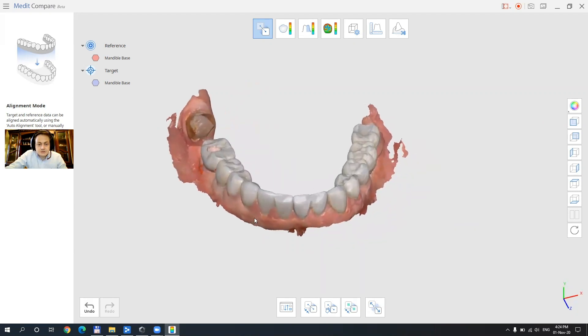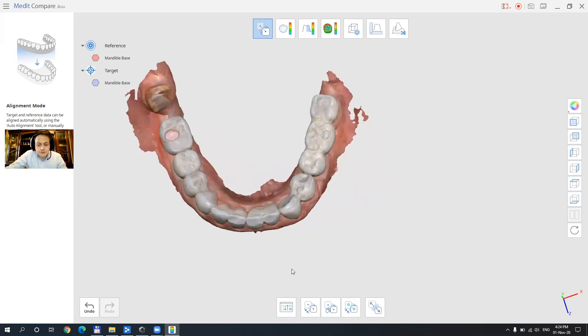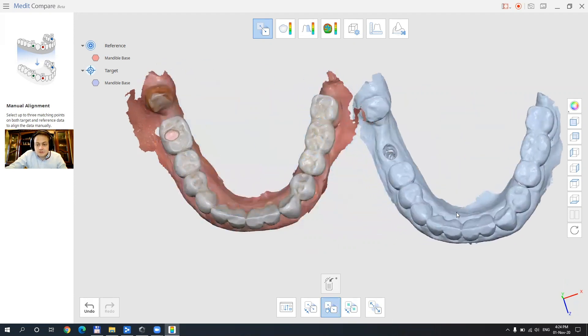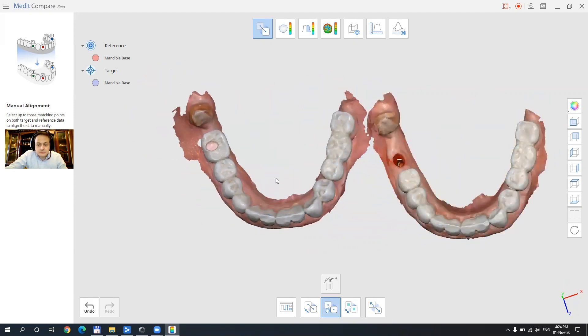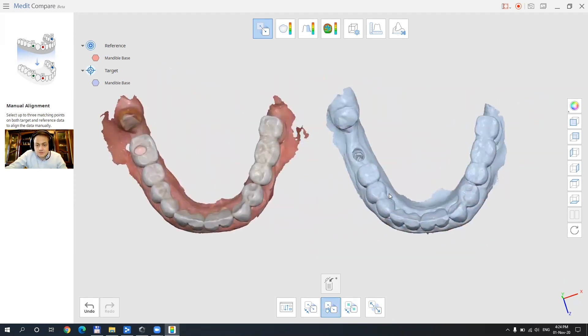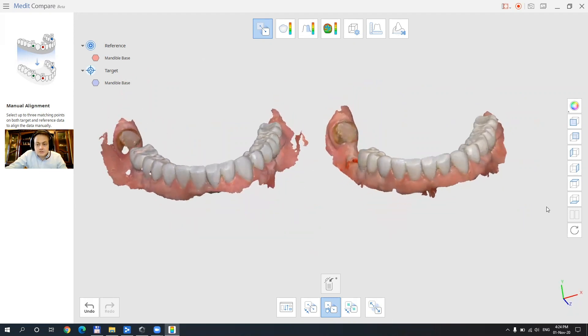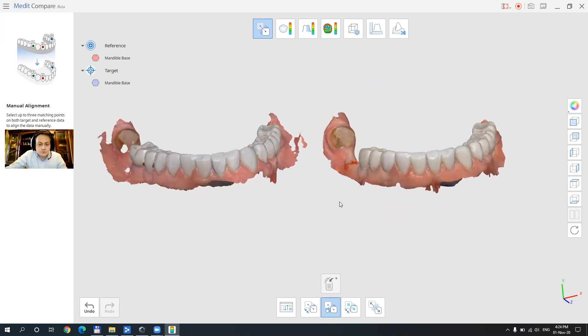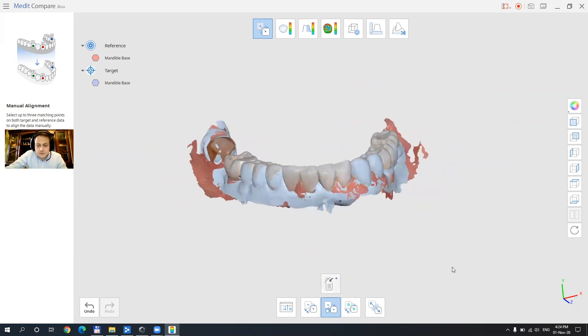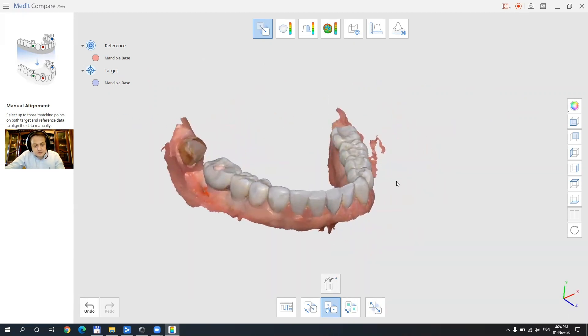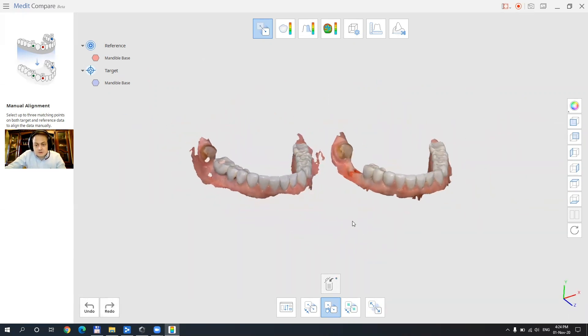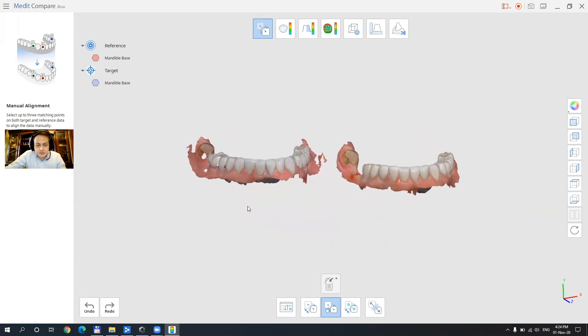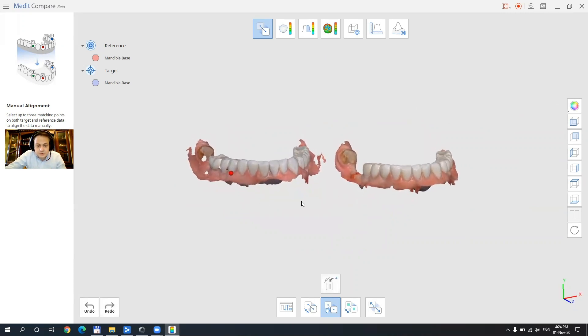But let's say this didn't work. So we're just gonna disalign them and try to manually align. Let me just do this. Manual alignment works as intended with one point alignment or three point alignment. Let's just try one point alignment first. As you know it from the iScan app. And it works very good. Now let's try the three point alignment again and see that feature as well.